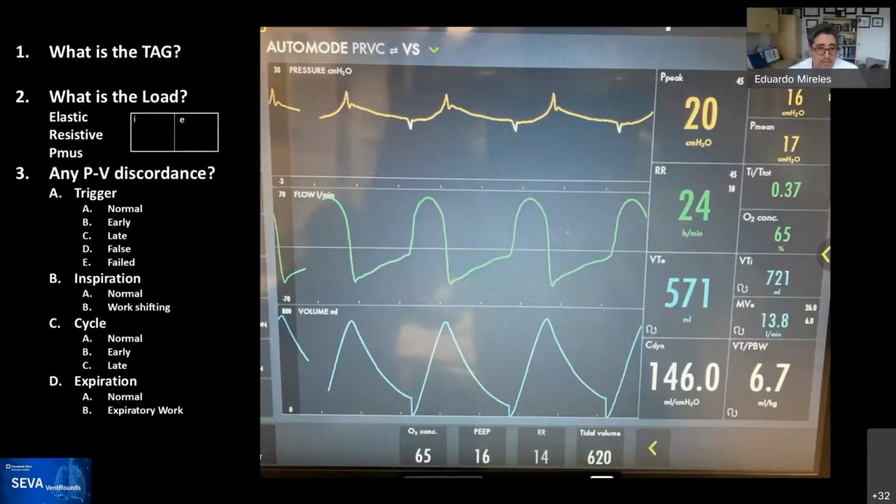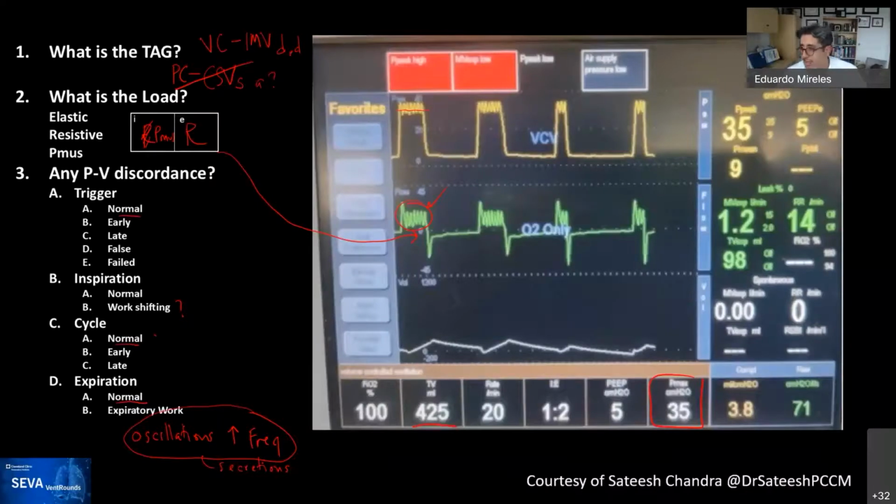Any comments about the last one, Ivor? Since I'll take the benefit of you being here. Any comments? I understand the issue about an ultrasonic nebulizer usually showing an oscillation throughout the cycle, but you will recall that you can trigger these things just off the inspiratory cycle. Oh, yeah. So I still need to be convinced in a pediatric patient, if this is what it is, that they weren't running an ultrasonic in parallel. Yeah. Triggering it off the inspiratory flow.